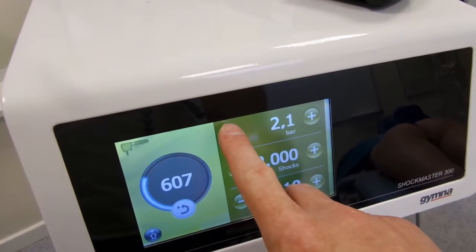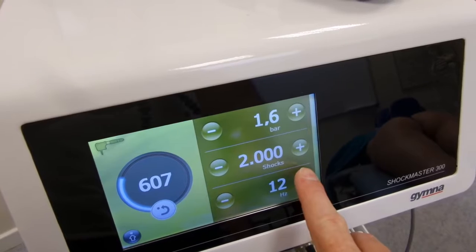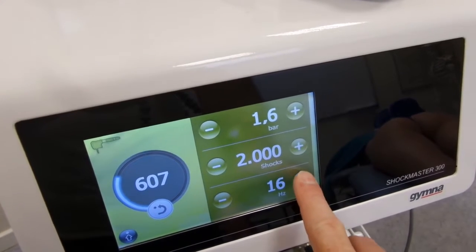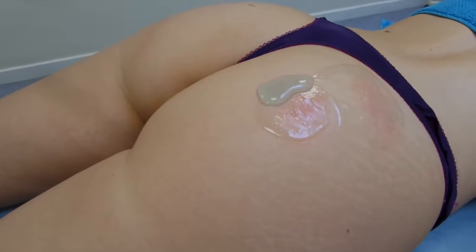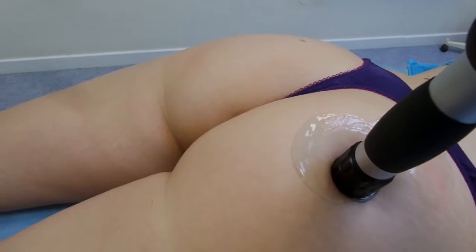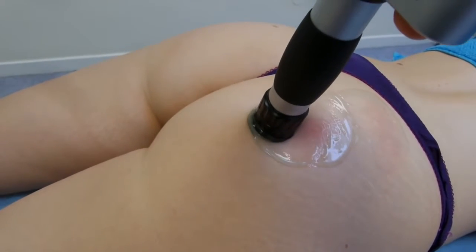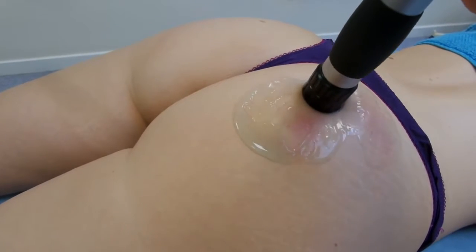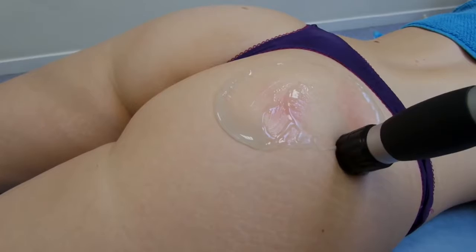As you can see, we've got to 607 shocks. Turn the pressure down to 1.6. We're going to turn the frequency up to 16 for a massaging effect. Reset the shocks. And we're back onto the piriformis gluteal area for 2000 shocks. Much faster speed now. Applying around the gluteal area.